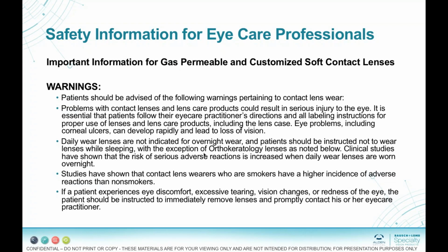What that means is that we still have to manage the dry eye condition as aggressively as we ever did, even though we're fitting them with the scleral. The dry eye condition has not gone away. For the lens to function properly visually, and to avoid buildup of deposits and drying of the lens surface, we need to keep that surface of the lens lubricated, just like we would the surface of the eye without the scleral lens.